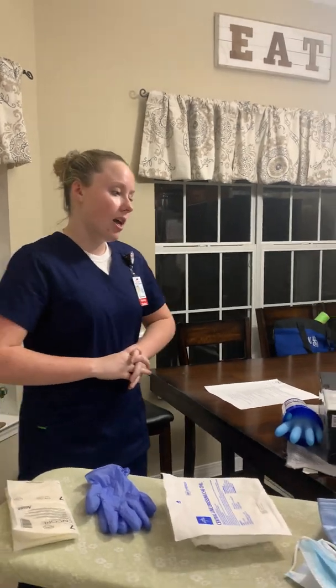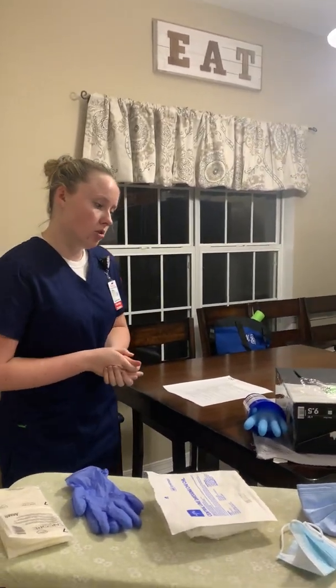Okay, so the first thing I want to do when I walk into a patient's room is greet the patient and perform hand hygiene. So I'm just going to say, hello, Ms. Jones. My name is Maslin Smits. I'm a student nurse with the University of South Alabama, and today I'm going to be cleaning and changing the dressing on your central line.